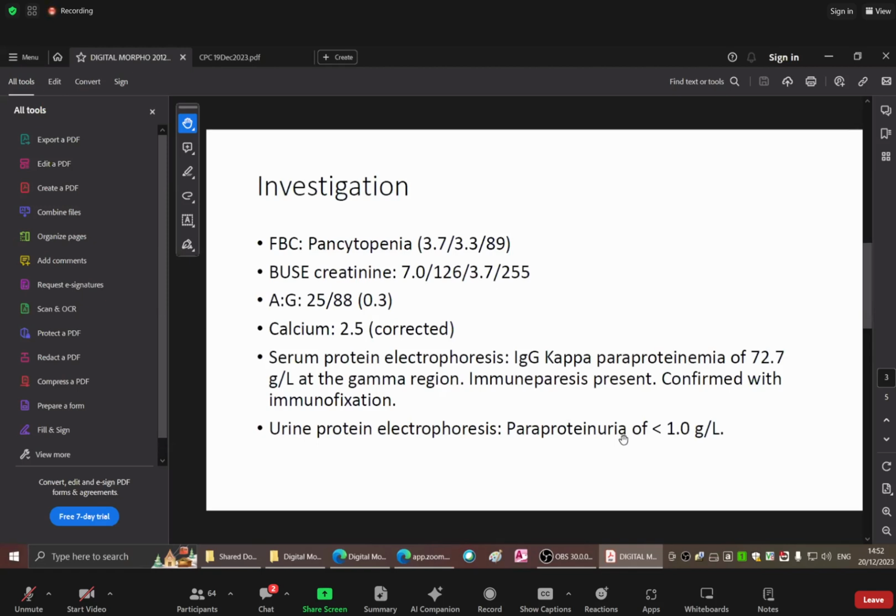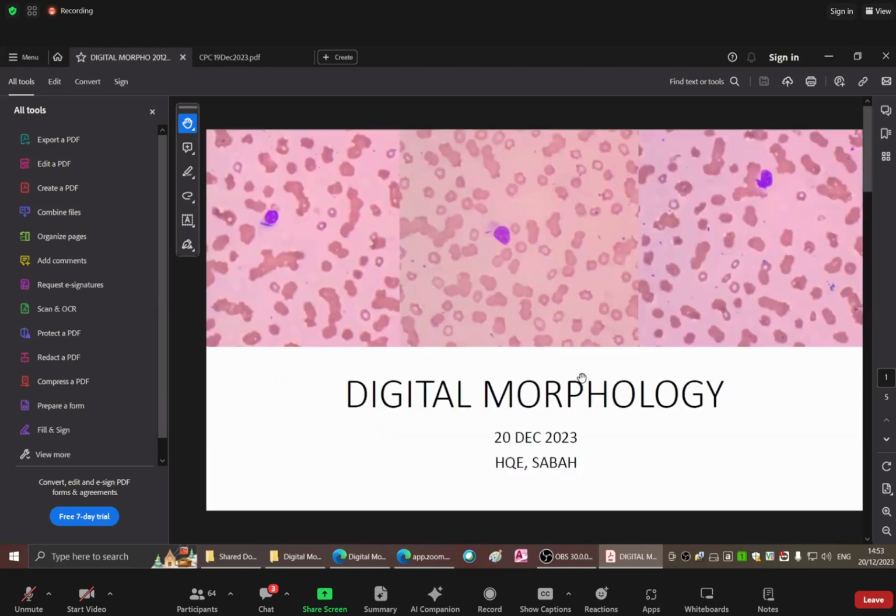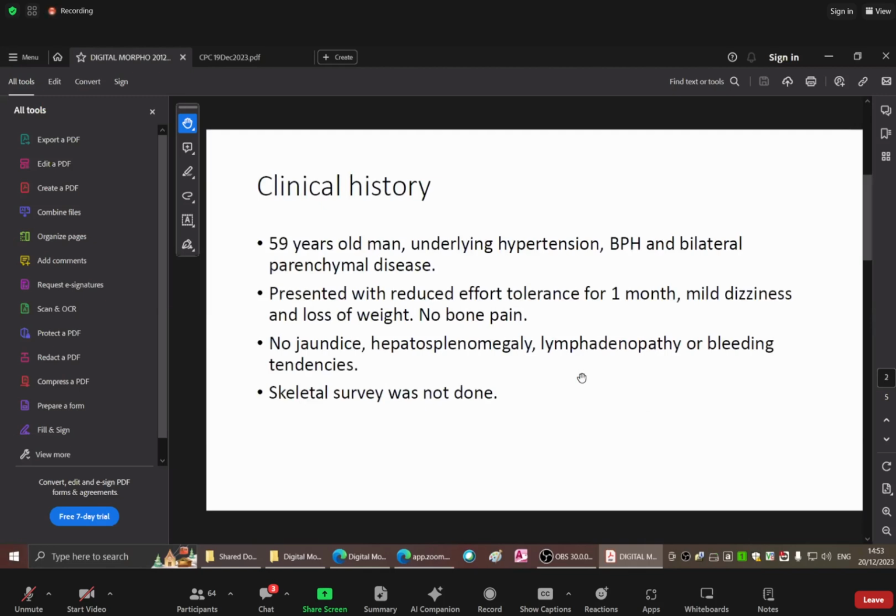Okay. So do you think this is actually lymphoplasmacytic lymphoma? The Ki67 should be lower in lymphoplasmacytic lymphoma. Okay. But LBCL involving marrow is quite rare. Usually, this patient should have extramedullary involvement like lymph node, but in this case, there is no lymphadenopathy or hepatosplenomegaly.